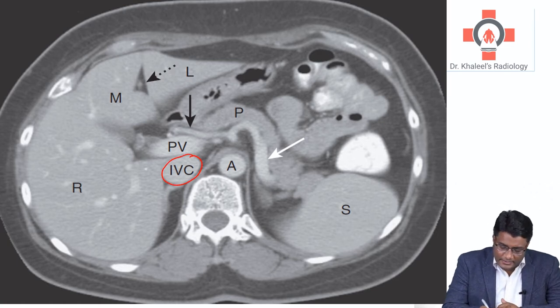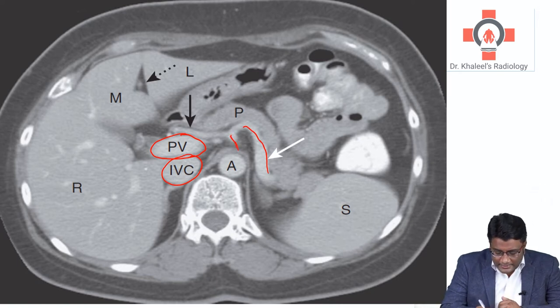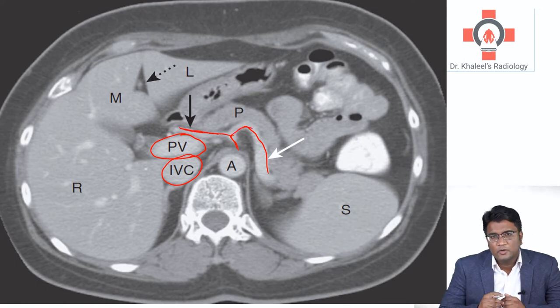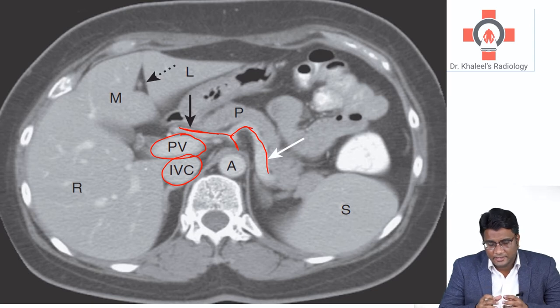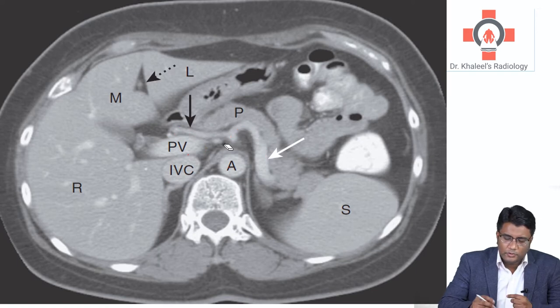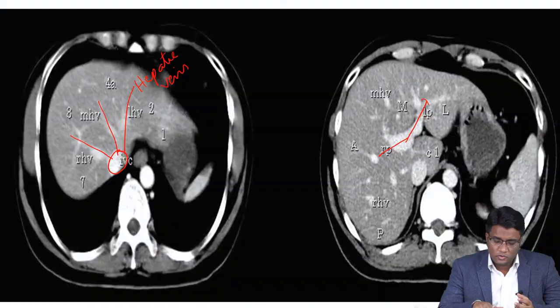You can see this is the area of the portal vein, this is the splenic artery, and this is probably a part of the celiac trunk that is shown, and this is your hepatic artery. So the hepatic artery and the splenic artery are coming from the celiac trunk. You can see: aorta, inferior vena cava, portal vein — and just anterior to the portal vein you see this small vessel, which is your hepatic artery.